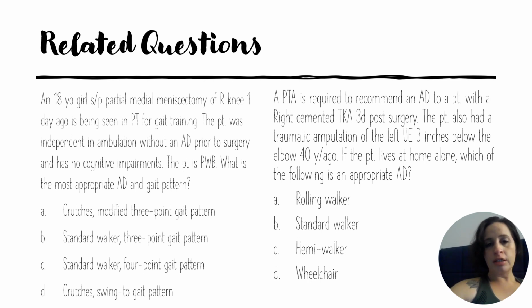Again, very restrictive in the sense of we want them to walk. They're recommending an assisted device to take home. He might still get a wheelchair to take home, but it's not about that. It's about, we got to get them to be the most independent they can. And if we put them in a wheelchair and don't have them walk at all, that's not good. And again, there's nothing that indicates that that's the level they're going to be at. So hemi walker, it's a pretty easy one.